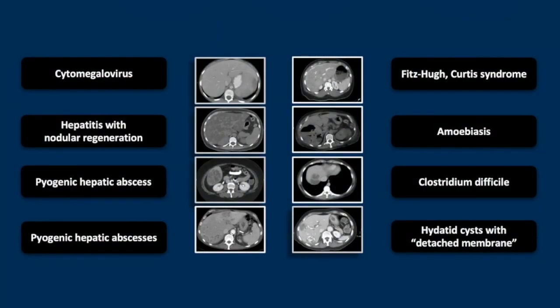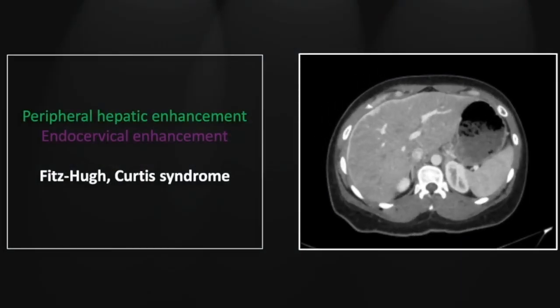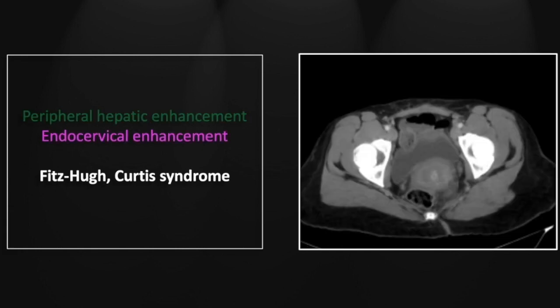Our next case is a gonorrheal infection resulting in Fitzhugh-Curtis syndrome. This is a beautiful example showing peripheral hepatic enhancement — parenchymal subcapsular enhancement of the liver that was only present on the early arterial phase images. In addition, the ultimate source of the problem can be determined to be a cervicitis. You see the enhancing mucosa of the endocervical canal — a pretty unusual finding — with significant edema or hypodensity of the adjacent cervix itself, putting that in marked contrast.